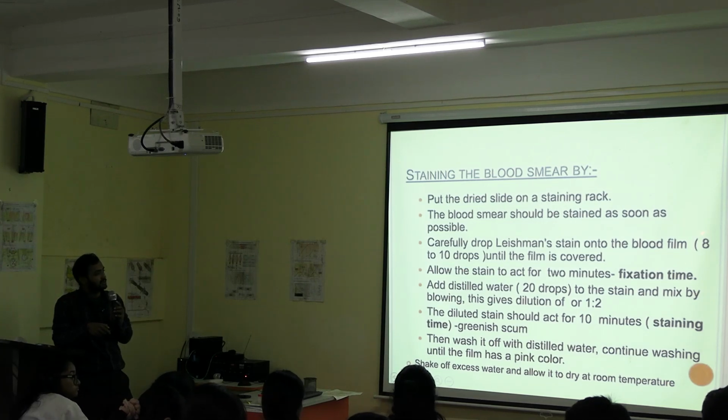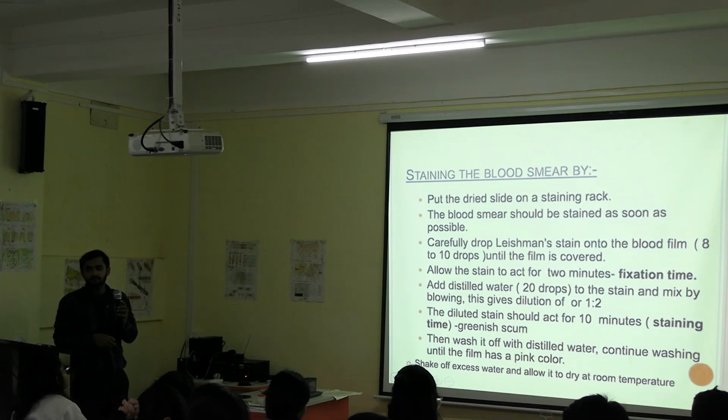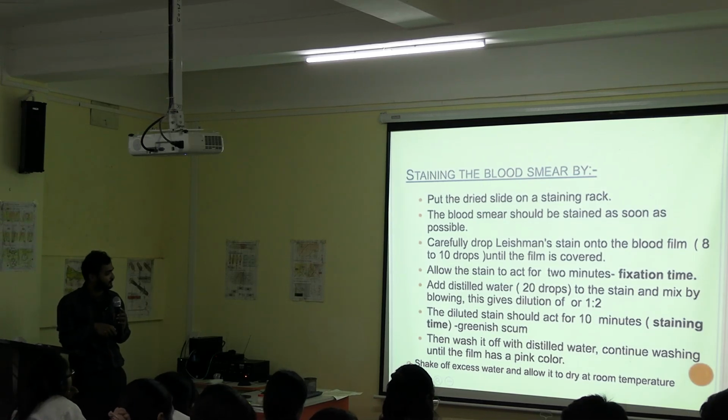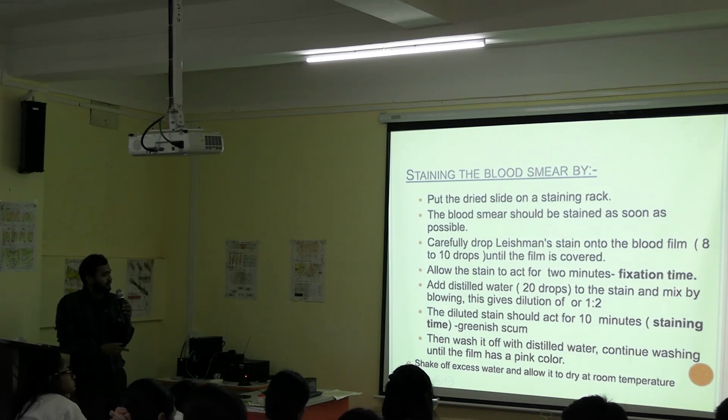If you are taking 8 drops, how many drops will you be giving of the distilled water? Double. Yes, it should be double. If you are adding 10 drops of Leishman, then the diluted stain should act for 10 minutes. So here, what happens?